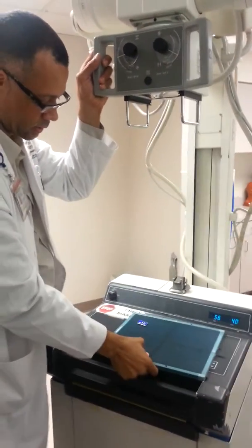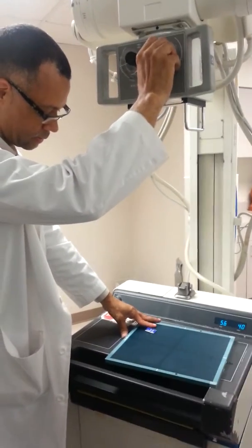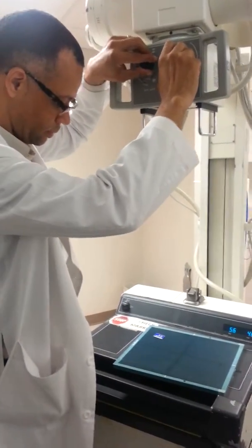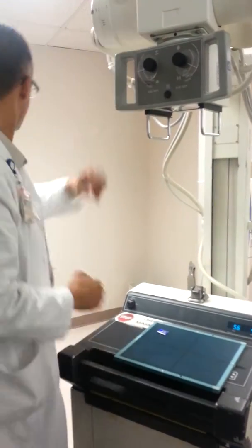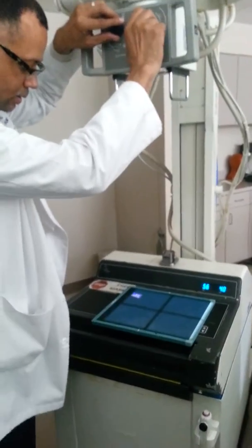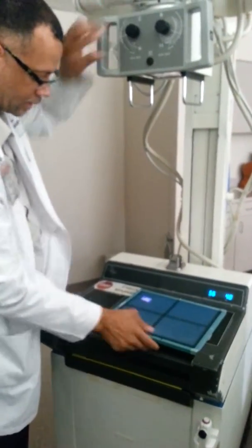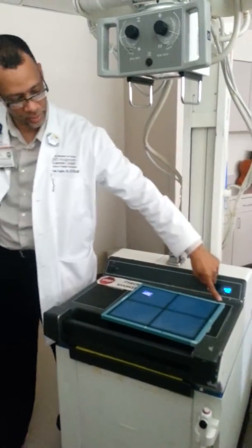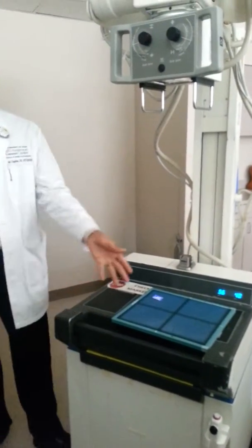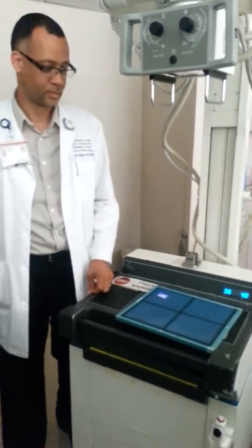Normally you use 100 centimeters. Most portable procedures are going to be at 100 centimeters. And you collimate your dimensions. Let me get the light. You always want to collimate the light field to dimensions inside the boundaries of the image receptor or cassette.